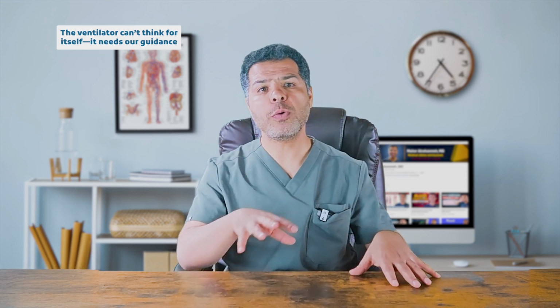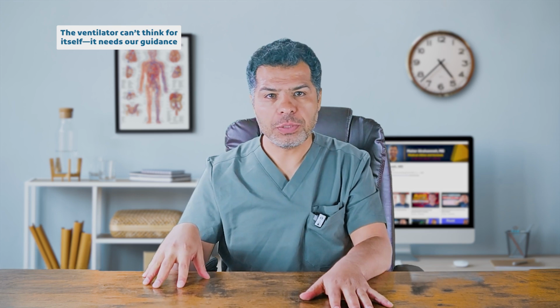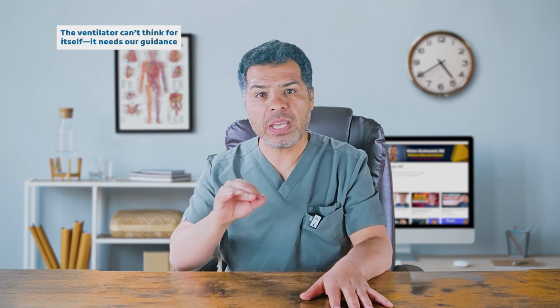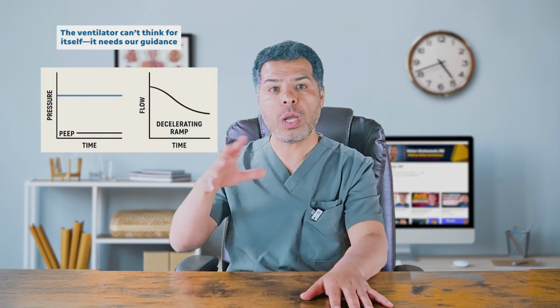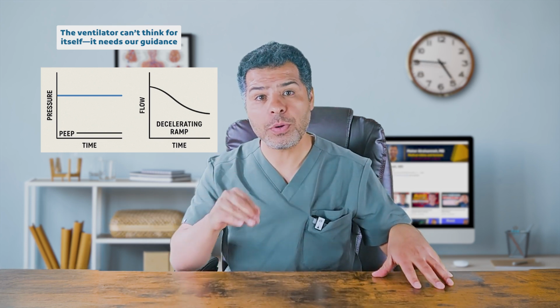And usually we set the flow rate between 40 to 60 liter per minute. How about the pressure target ventilation? Here we tell the ventilator to apply a fixed amount of pressure on top of the PEEP throughout the inspiratory phase until the breath is delivered.